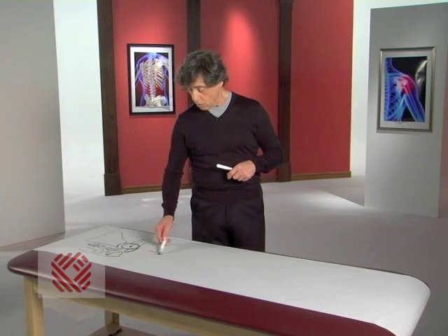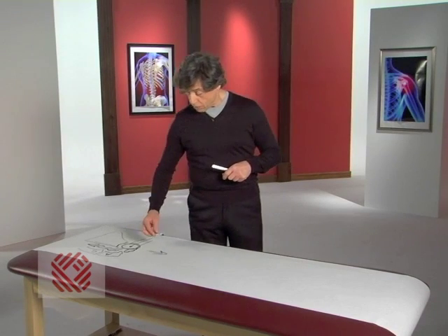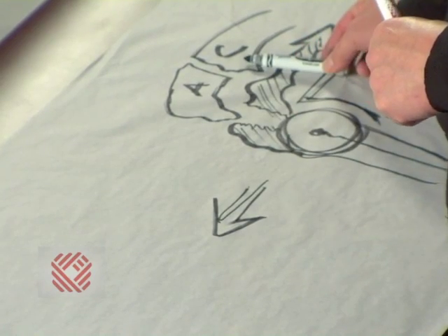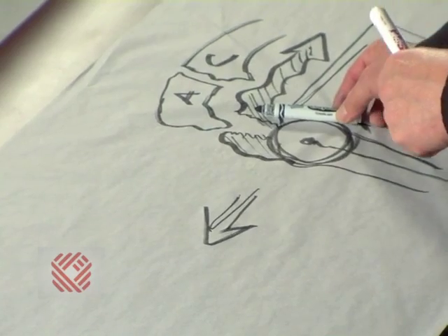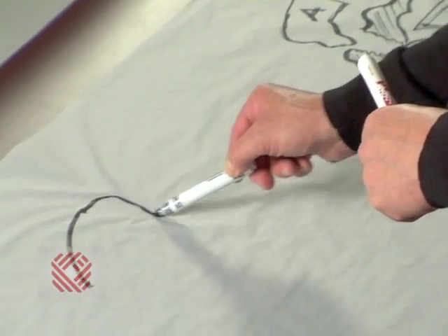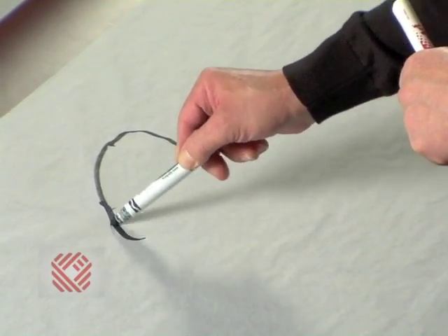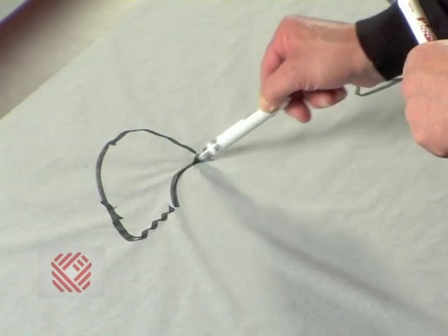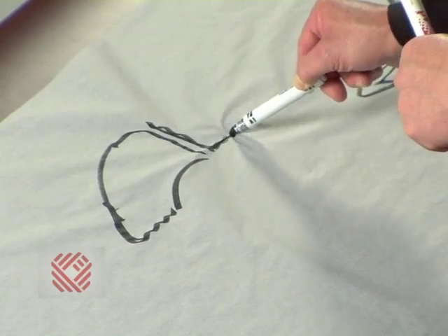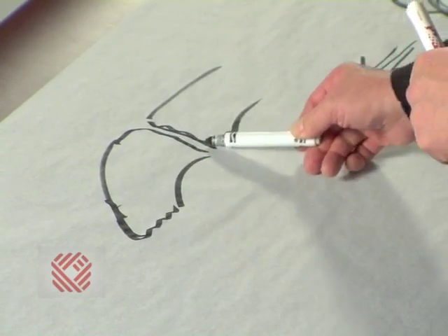The role of arthroscopic surgery will include removing these bone spurs and repairing the tendon. Through the arthroscope, we bring in a little burr that looks like a little dremel tool that removes the spurs.